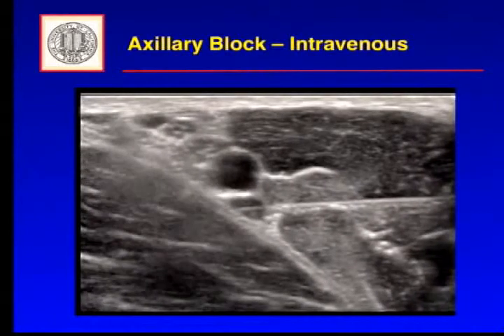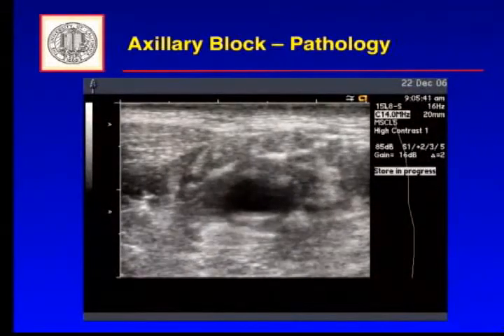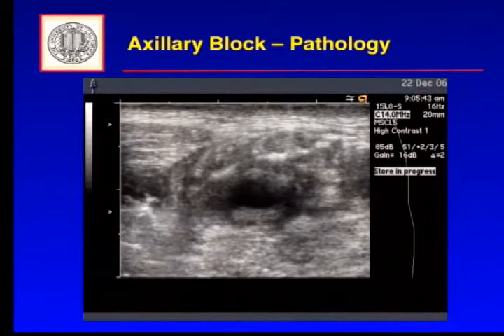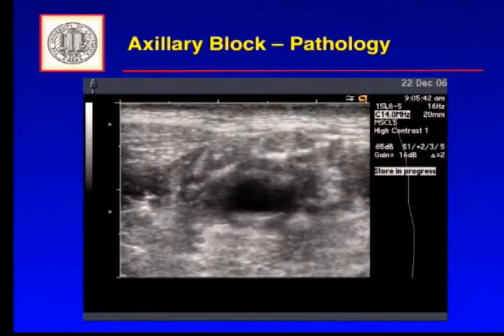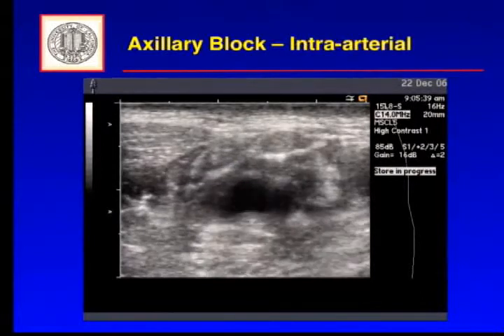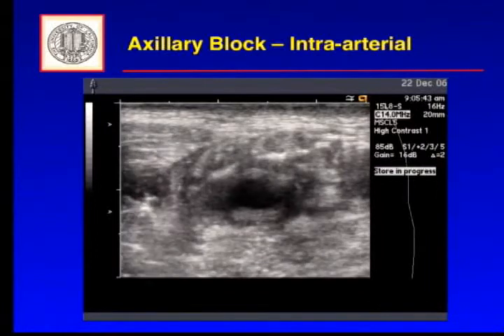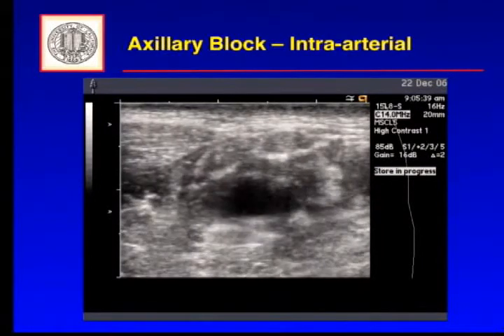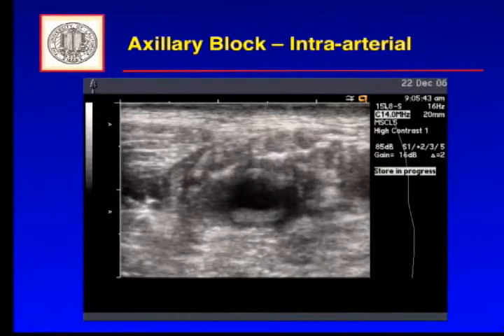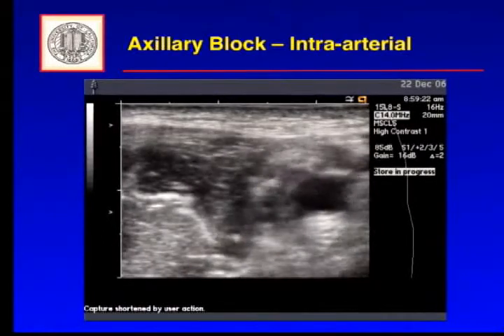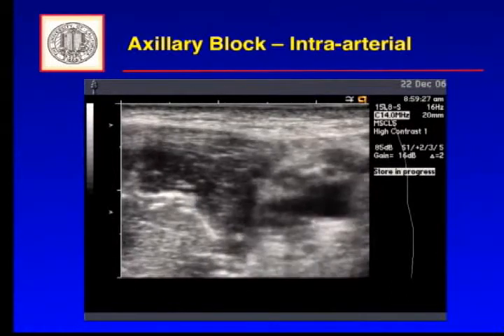Here's another example in the axilla — this is an intraarterial injection rather than intravenous. It looks very similar, but the flow in an artery is more rapid, so the bubble cloud disperses more rapidly because it's carried away outside the plane of imaging. Here's an out-of-plane technique example showing an intraarterial injection.